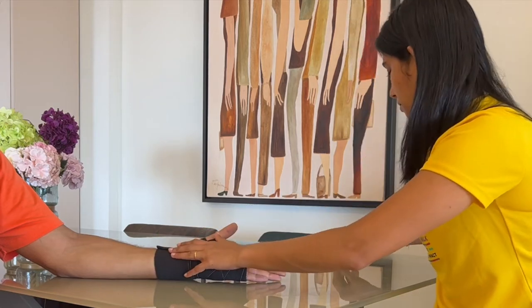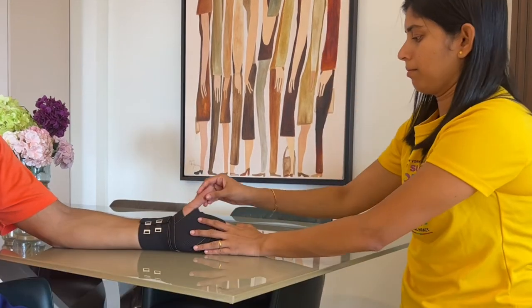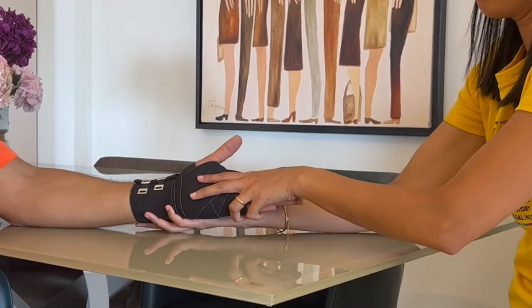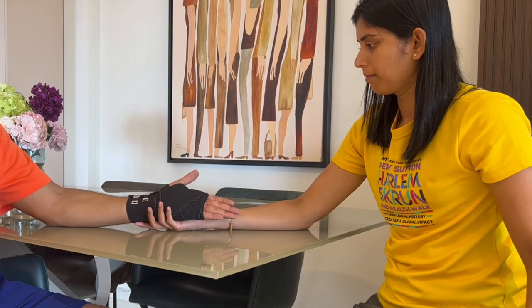I'll do a quick check to see if everything is alright. I'm also asking my patient to move the thumb and all the fingers. Free movement of all the fingers is important for good blood circulation and to avoid joint stiffness.